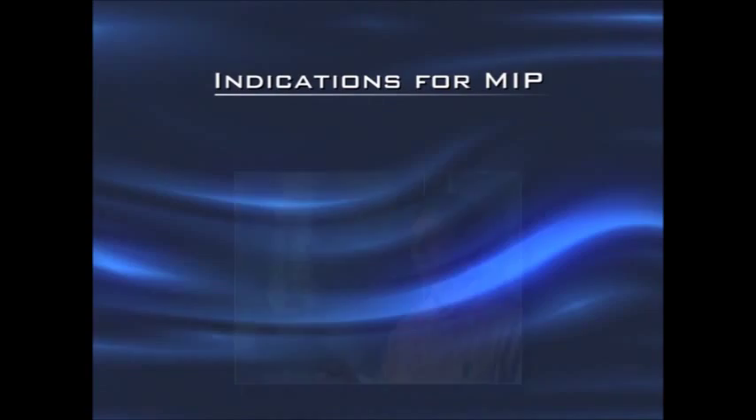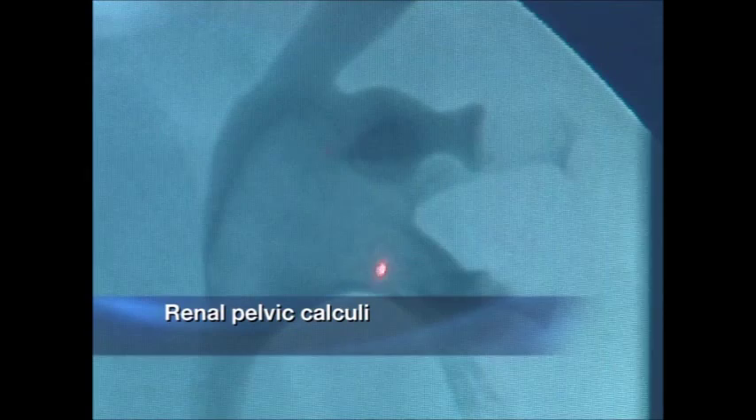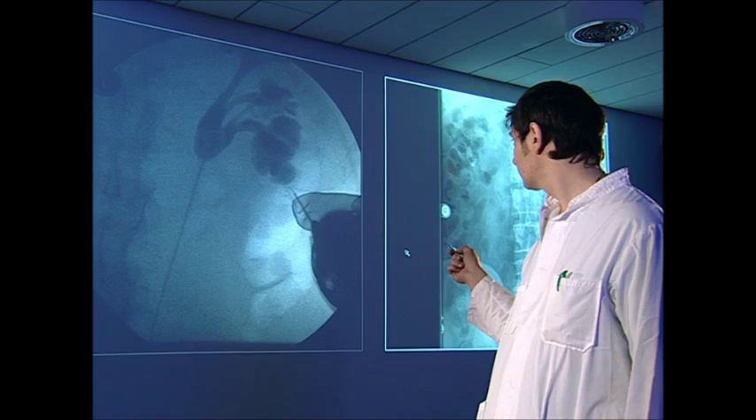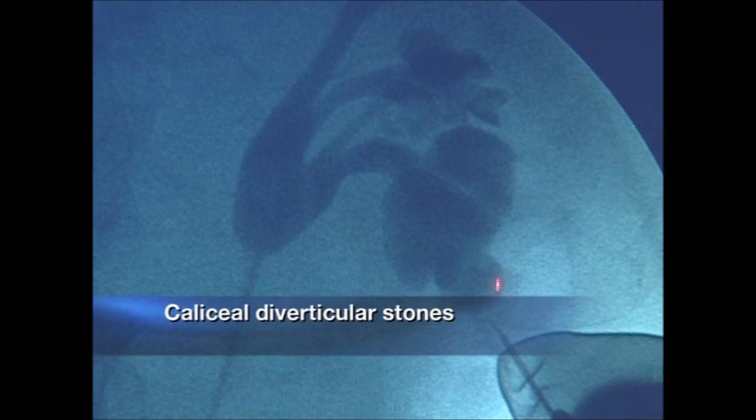After informed consent, we perform MIP for lower pole stones starting from 8 mm in the case of medial and superior caliceal stones, and starting from 15 mm in diameter in the case of renal pelvic stones. Other indications include caliceal diverticular stones, anatomical variations, and persistence of stones following ESWL.